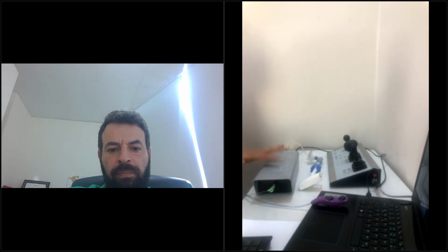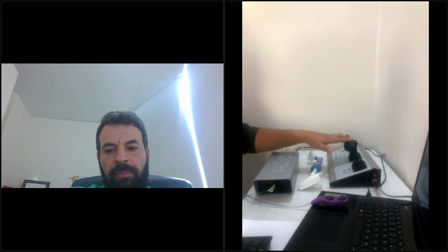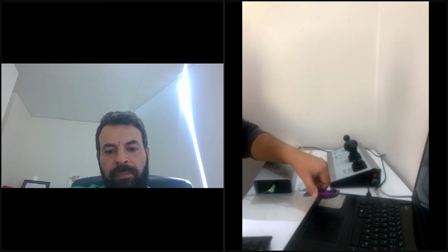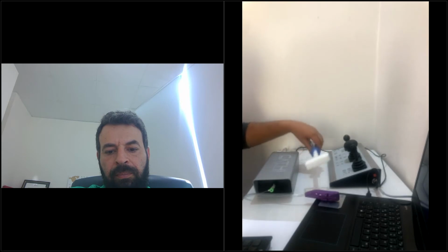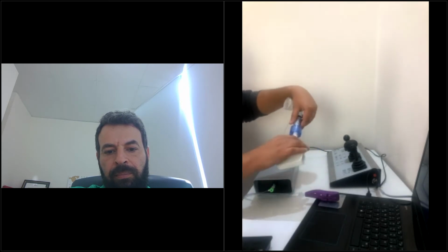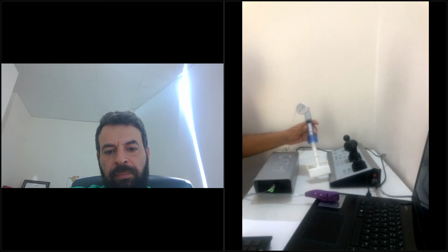Okay. This is the Cathis Smart. I will point when I am talking about one. This is the Cathis Smart device. This is for the insertion, and this is the main unit. This is the control unit for moving the table. Here we have the saline and the contrast for X-ray. This is actually like the real devices. It looks like real devices. This one is the inflation one. If you can see it here, it's exactly like the real one.